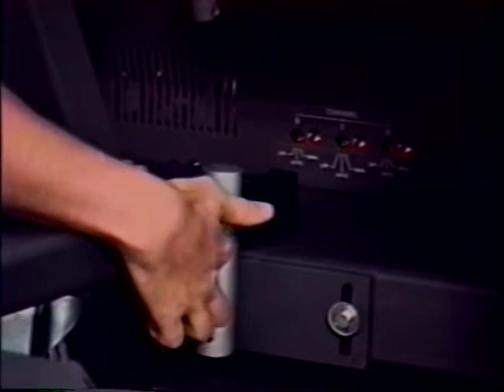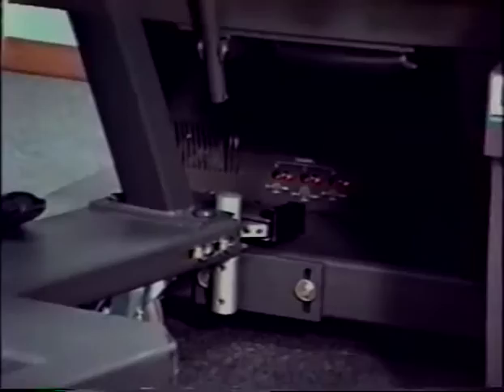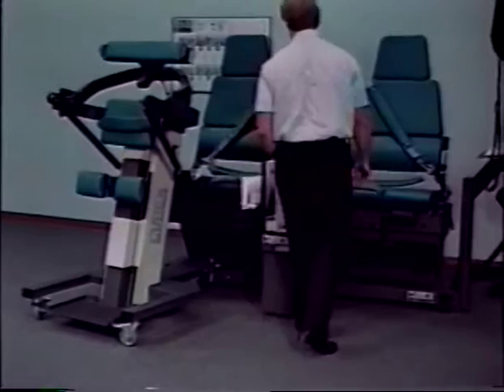Push the clamp assembly of the TEF modular component onto the docking post. Power up the Cybex 6000 and set it to manual mode.